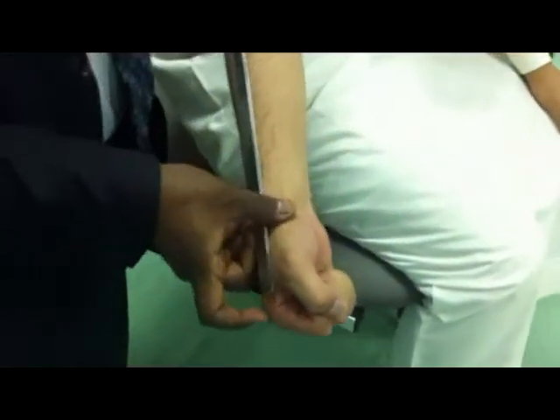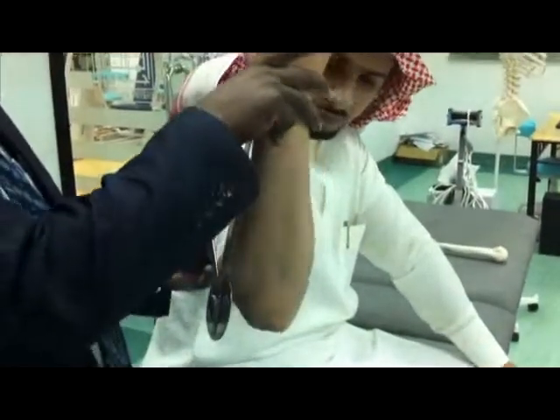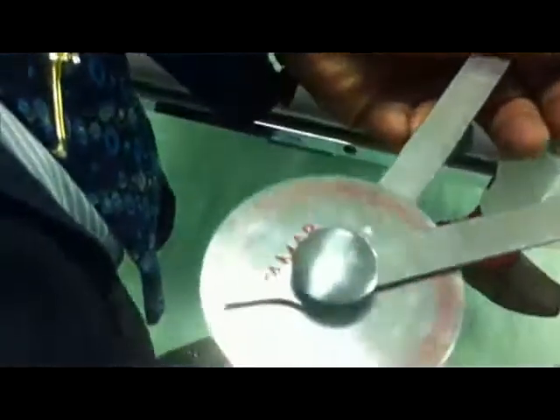Stable arm is for the humerus. Mobile arm to the ulna. Starting from 180 degrees, I will do flexion. It went from 180 up to 40 — that means 140 degrees of elbow flexion. That is what he has: 140 degrees of flexion.